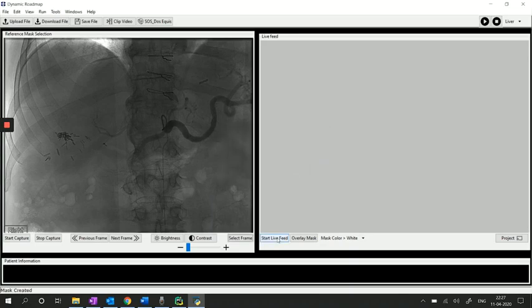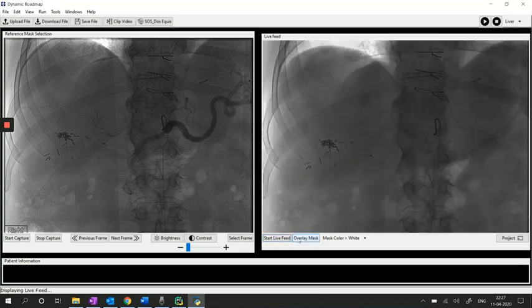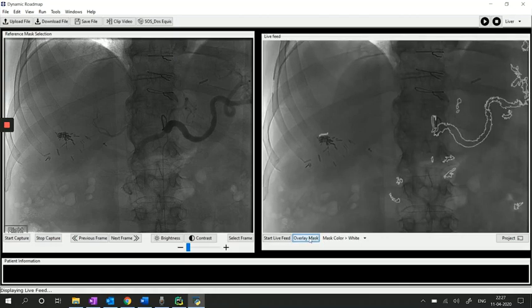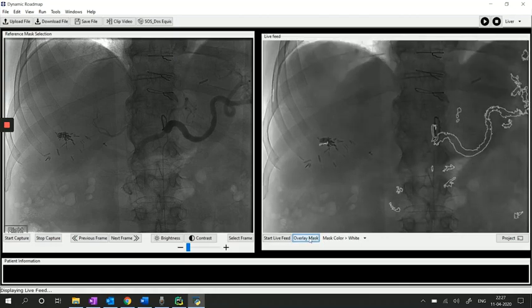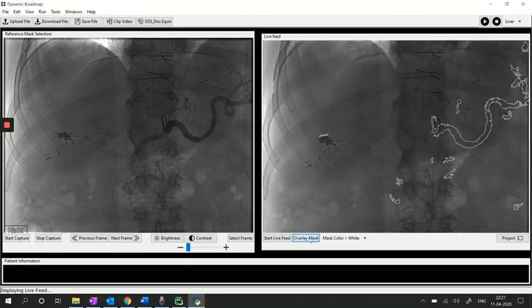Now, when performing the actual procedure, you start the live feed and in order to view the arteries, you just have to hit the overlay mask button and boom, you can now clearly visualize the arteries without any further injection of contrast.